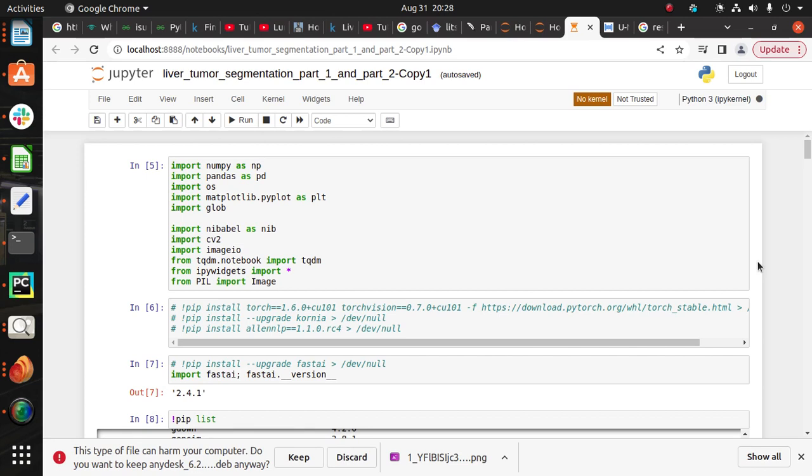In liver tumor segmentation, our goal is to create a model which automatically segments the liver and tumor from the training images. So here I can show you the implementation part. First of all, we have to import all the important libraries.